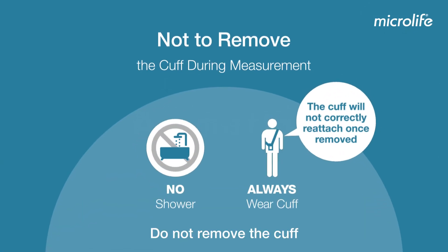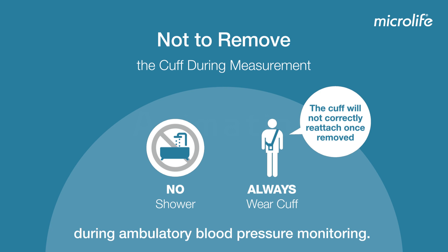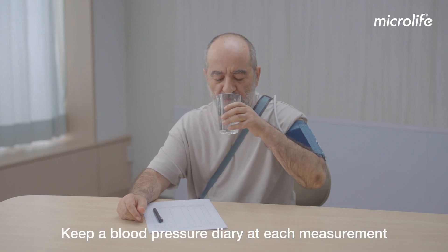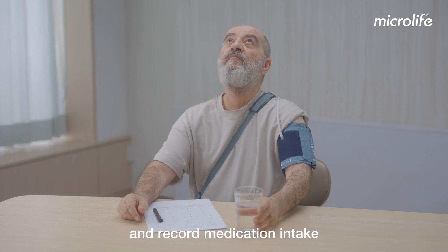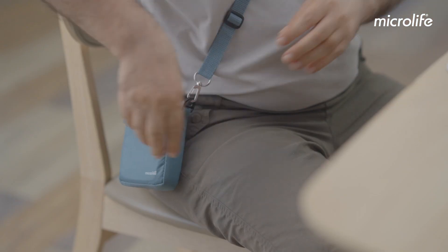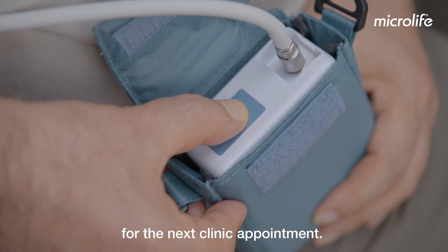Do not remove the cuff and do not take a shower or bath during ambulatory blood pressure monitoring. Keep a blood pressure diary at each measurement and record medication intake by pressing the medication button for the next clinic appointment.